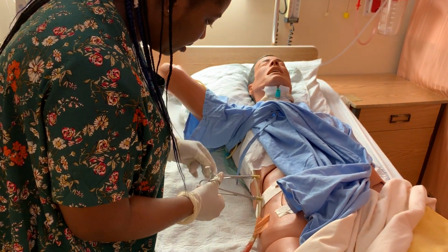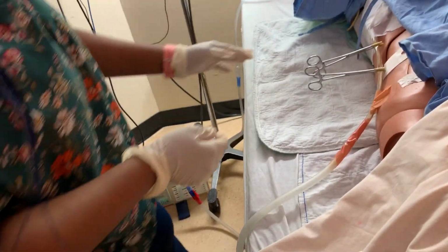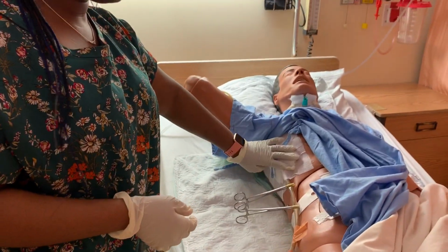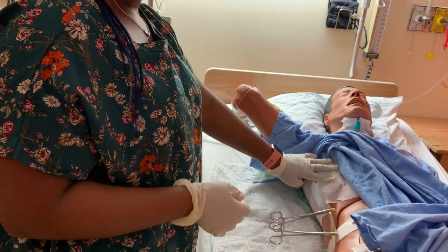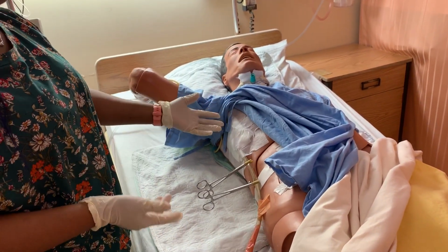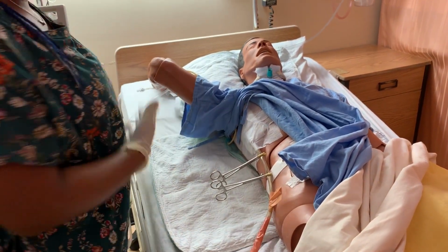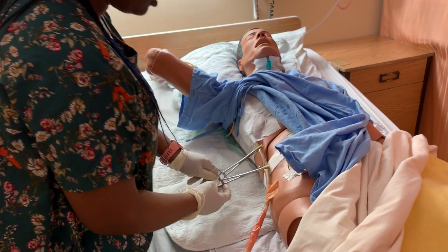And I'm gonna clamp it there as well. So the bubbling has stopped, which means it's probably because of the dressing. So I'm gonna change the dressing first, as he's due for a dressing change today. But after putting the dressing on, if it's still bubbling, then I'm gonna call the doctor about it.